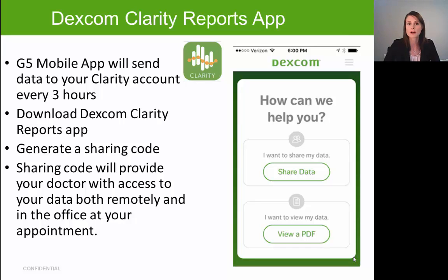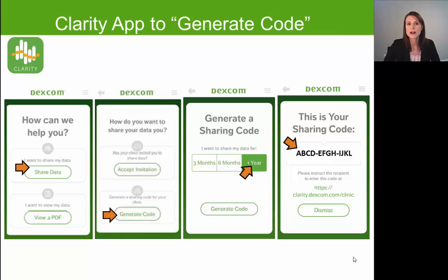The home screen of the Clarity Report app provides two options: 'Share Data' and 'View a PDF.' If you select 'View a PDF,' it will generate a PDF report with graphs and charts from Clarity on your phone, defaulting to the most recent 14 days of glucose information. If you select 'Share Data,' it provides two options for sharing your glucose information with your physician — let's talk about 'Generate Code' first.